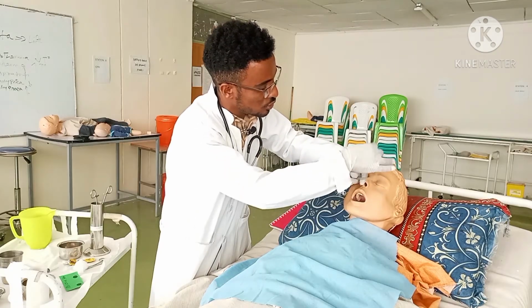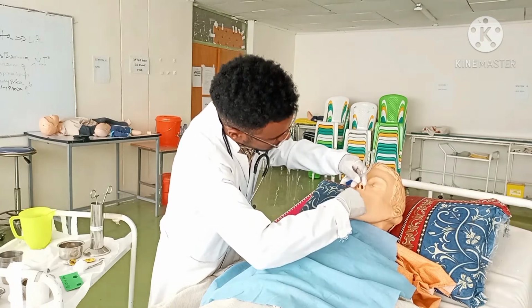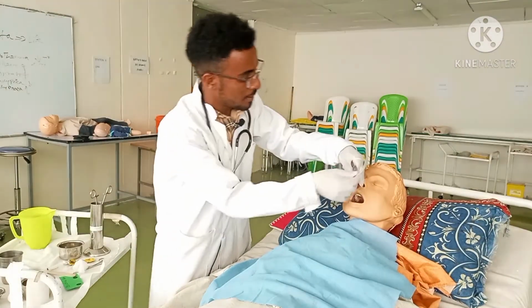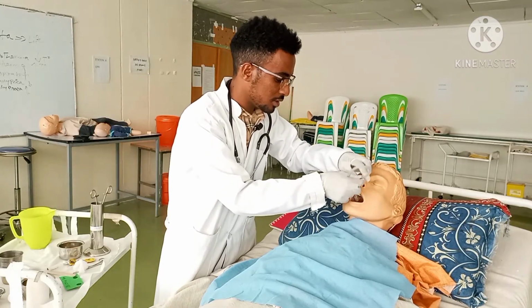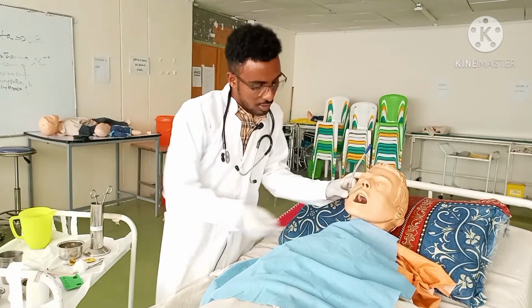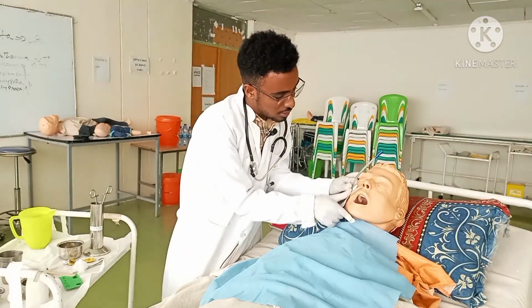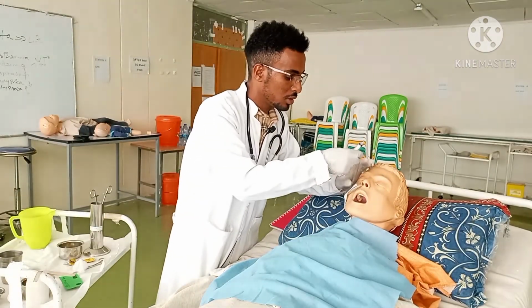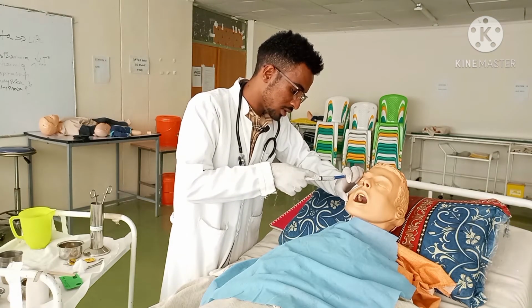After advancing it, use a tongue blade and observe whether the tube is in the proper place or not. Okay, the tube is advanced forward. Then push it down until the marked position. After that, you have to make sure the patient has no discomfort. Tape it here, and to make sure whether the tube is in place or not, aspirate the gastric juice.